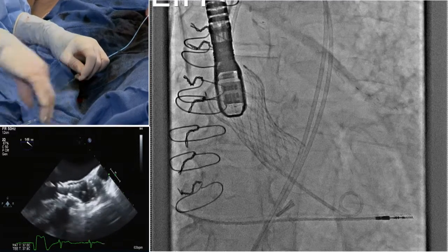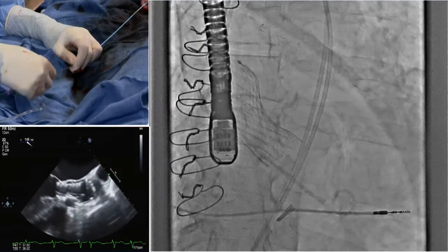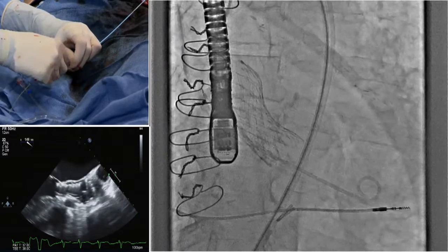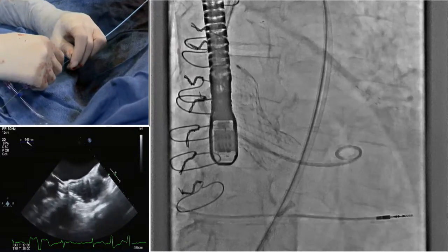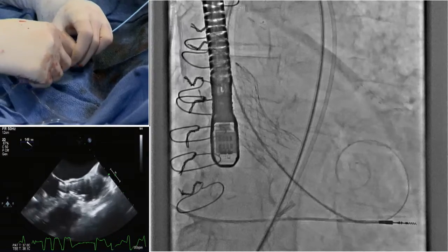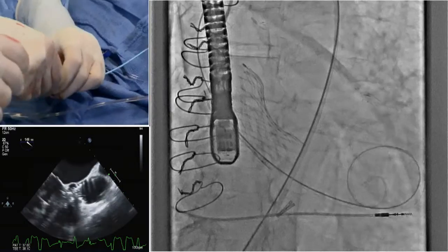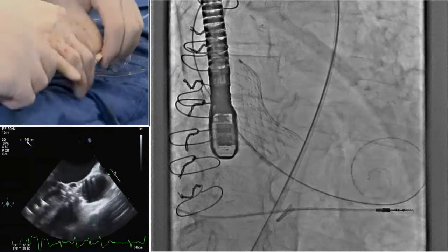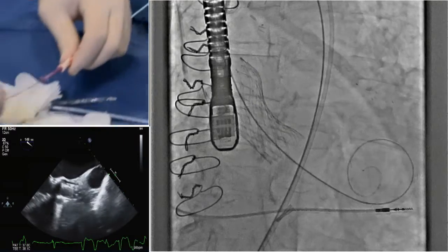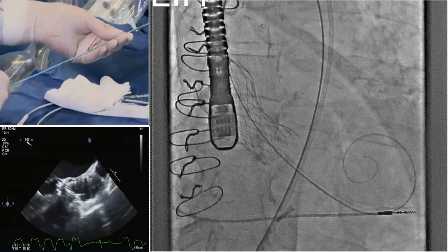It's 4 centimeters long. We will rapid pace. The Nucleus doesn't seem to move that much. Unfortunately, we don't have access to the True balloon, which is probably the better non-compliant balloon. The Nucleus is not a non-compliant balloon, obviously. The advantage being it doesn't move so much. I don't know if anyone has a non-compliant balloon that they prefer that they have access to. Unfortunately, we don't have the True balloon, but in the absence of that, we're going to go with the Nucleus 25. And again, just based on what we think the mean, and we're not going to blast the hell out of this thing.